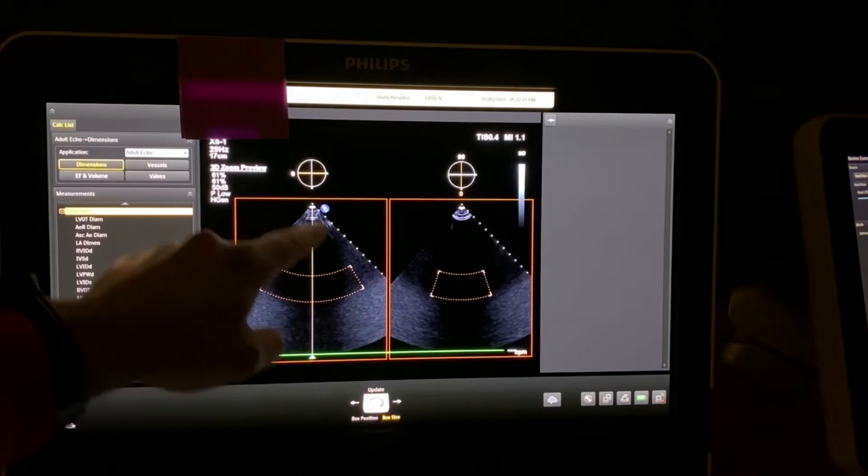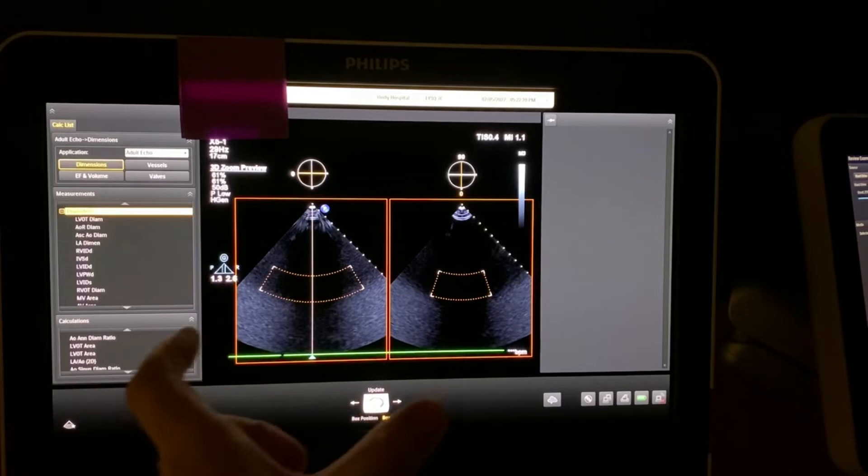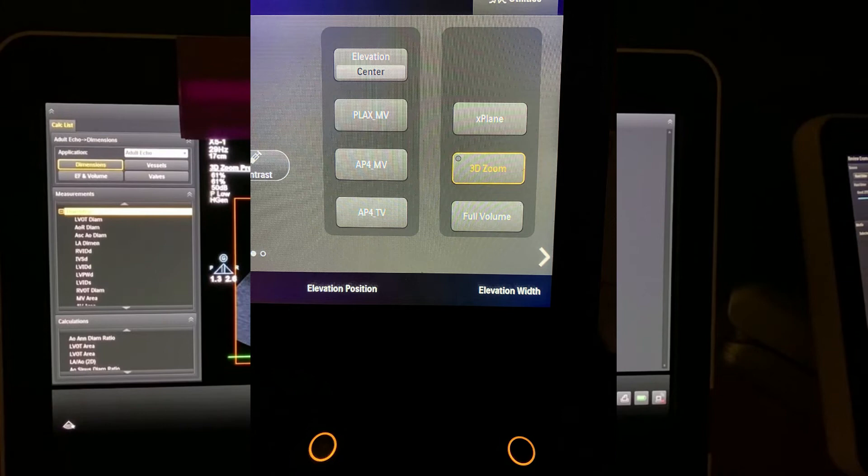In a transesophageal echo it will look something like this on the left hand screen. Now on the right hand screen, in order to make that wider, the far right upper knob is the elevation width knob and I can make that bigger or smaller.